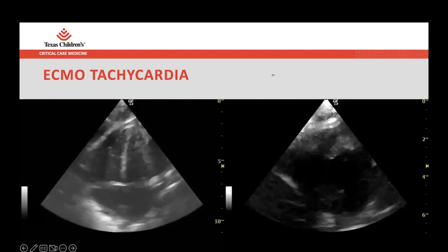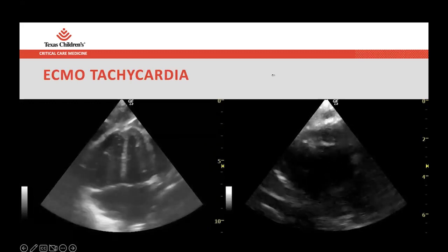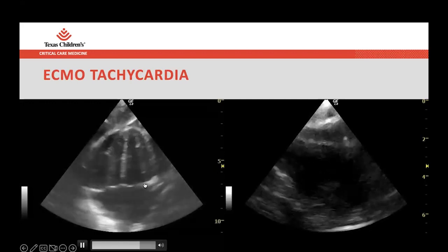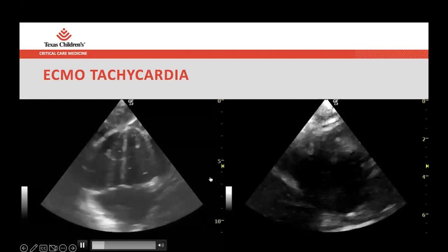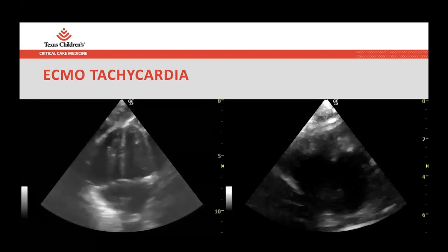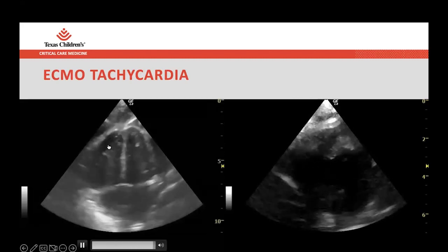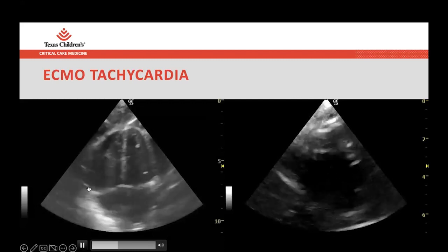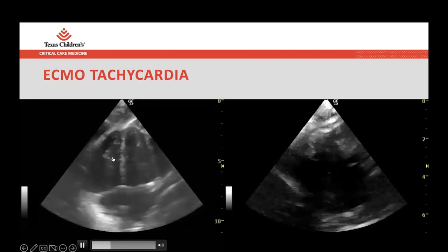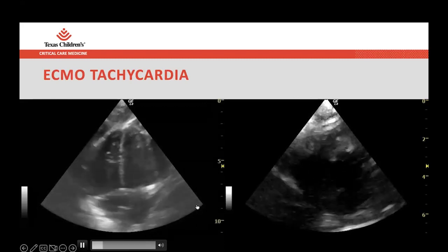Left looks like it's moving a little bit more, right? This is something where I have to tell you that this is not a foreshortened view. Maybe I could have gotten the mitral valve to show up a little bit better, but the LV was squished relative to the right. The right still has good longitudinal contraction. We can see that with how well the tricuspid moves and everything, but it really doesn't empty the same way the left does.